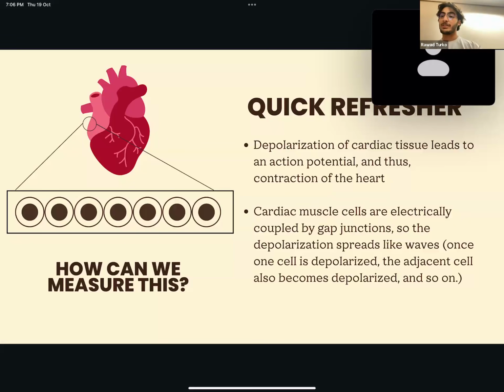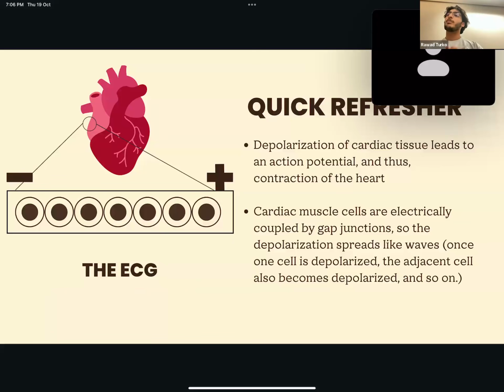We want to measure this activity as it's going through the heart, as it's going whichever way in the heart. We want to measure this activity. How can we do that? The ECG. Okay, but let's get more specific.